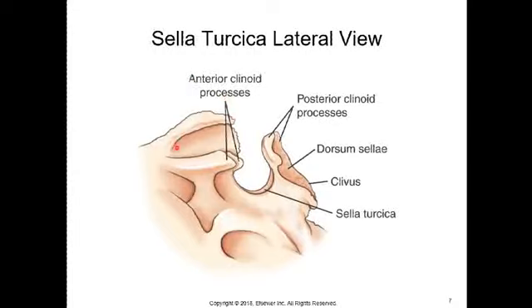This would be a lateral view of obviously your sphenoid, and this is the sella turcica. And the reason why I like to emphasize the lateral view of the sphenoid is because if your sella turcica is completely in profile, so if you didn't actually see this section and all you saw was the outer edge, that means that you have a good lateral skull or lateral facial bones image. So the sella turcica is really your tell if the patient is rotated or not.